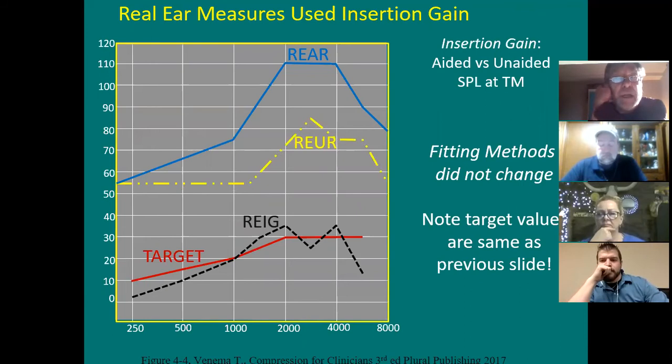Take the hearing aid, stick it on top of the tube, turn it to its 2/3 volume, and have the very same 55 come out of the speaker again. Do the loop, do the loop, do the loop, and look at this, real ear aided response. So real ear unaided response, real ear aided response.